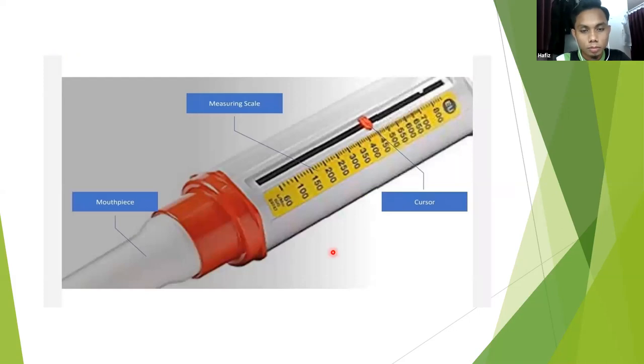Okay, these are examples of a peak flow meter with certain labels. This is the mouthpiece, measuring scales, and also cursors. Okay, next.